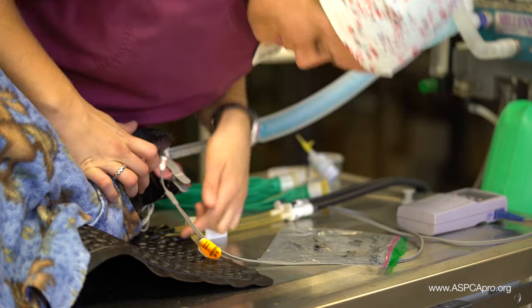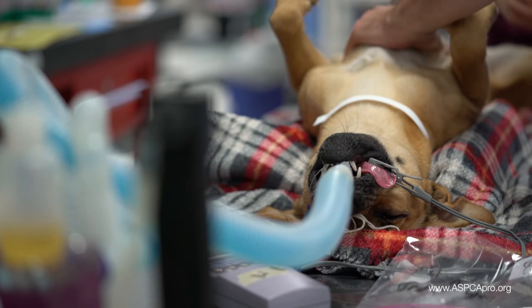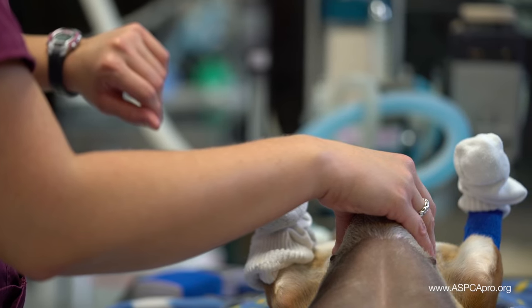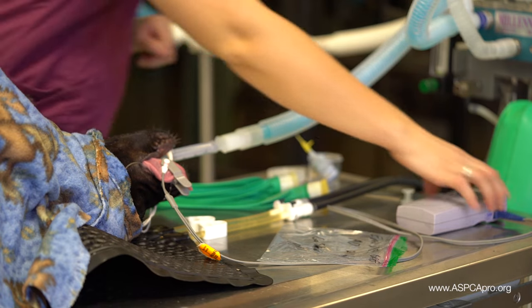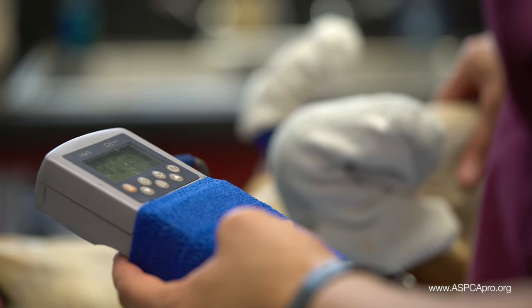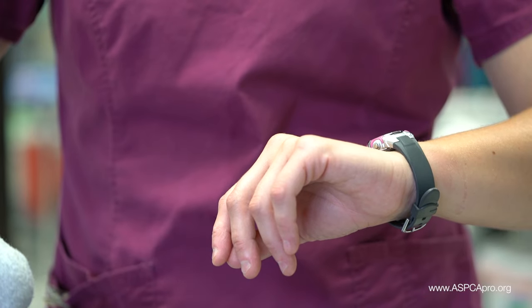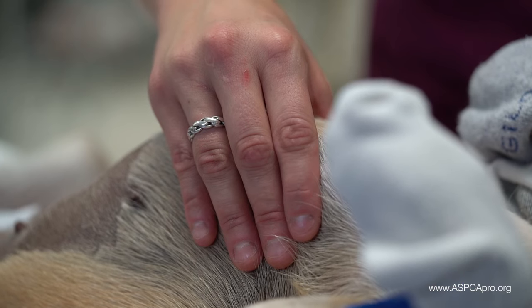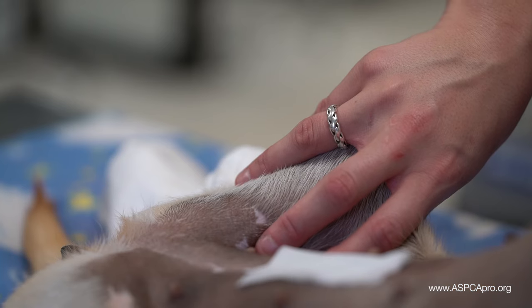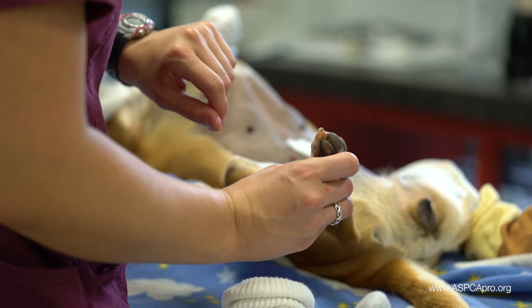For dogs, heart rate will also vary greatly depending on the size and age of the animal, so it is more important to keep track of trends than actual numbers. To monitor heart rate, a pulse oximeter can be helpful but may not always be accurate. Therefore, physically checking the patient's heart rate should become habit. Place a hand on their chest to feel the heart beating, or palpate the pulse rate digitally using the femoral, dorsal metatarsal, or metacarpal arteries.